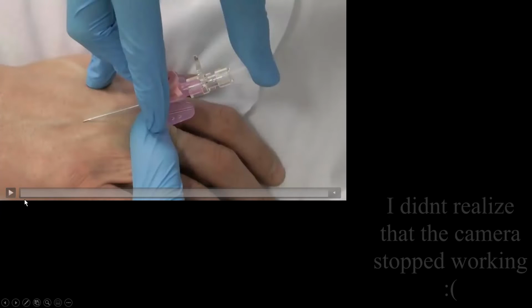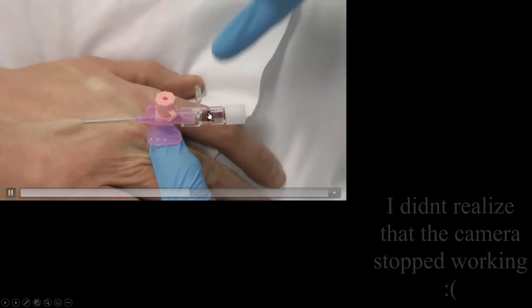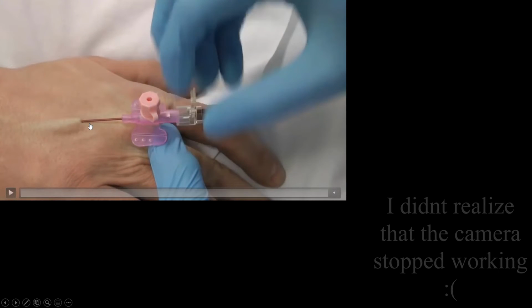Okay, I'll show you another video where it is clearer. Again, they are pushing the stylet inside the vein and you can see the blood coming in the flashback chamber. And then once the stylet is pulled back, you can see the blood coming in the IV cannula. So there are two flashbacks, one in the flashback chamber, second in the IV cannula when the stylet is pulled back and the watertight seal is broken.